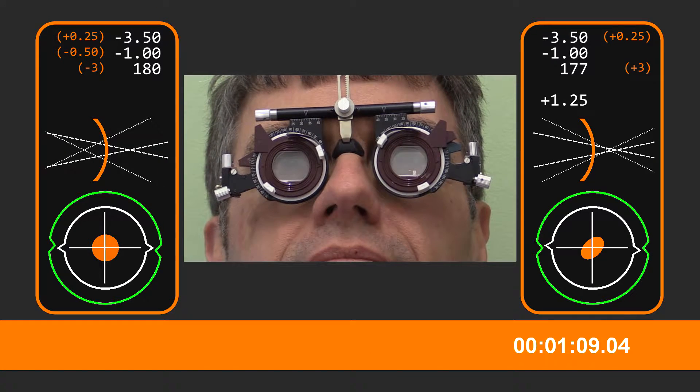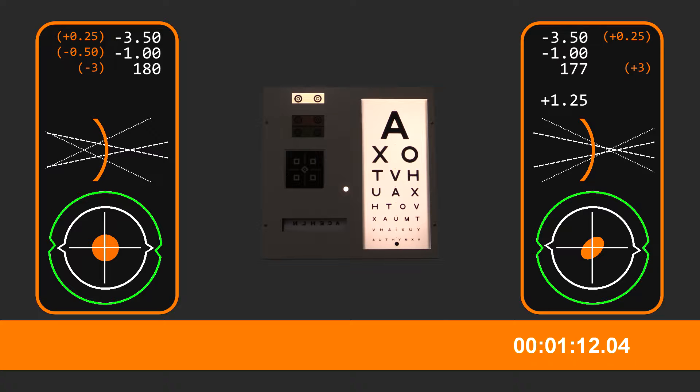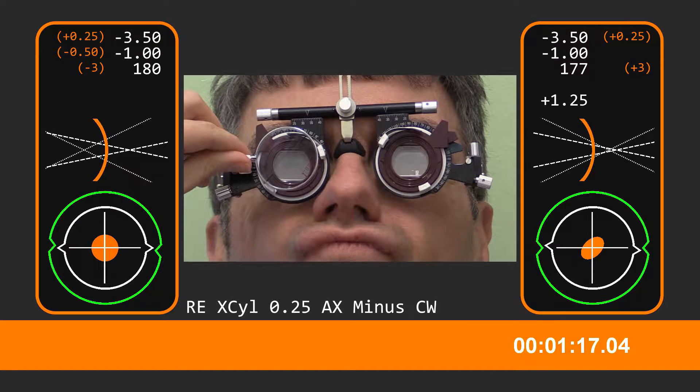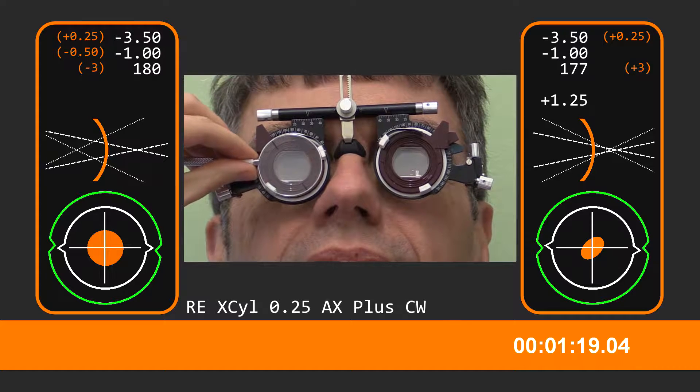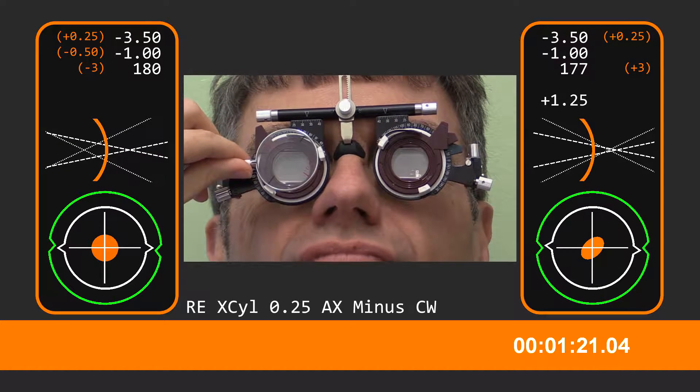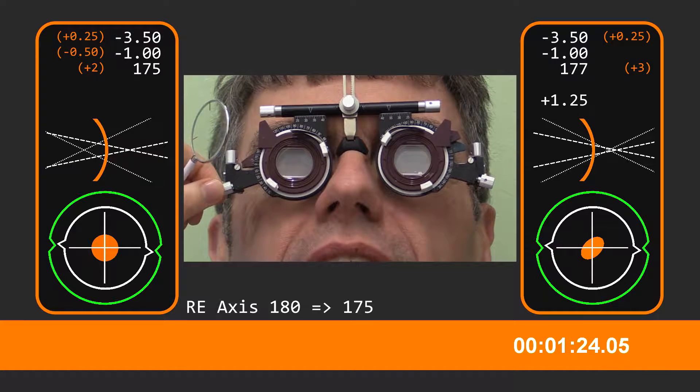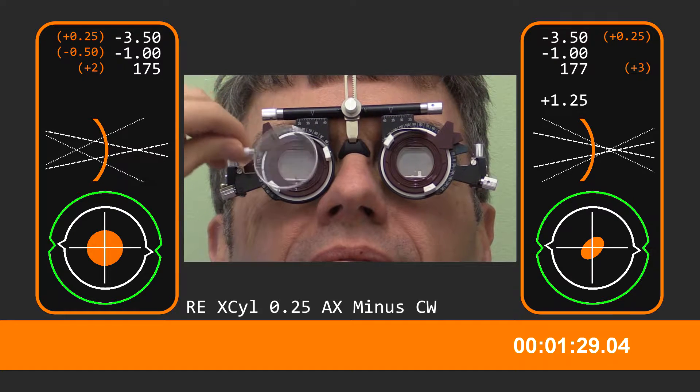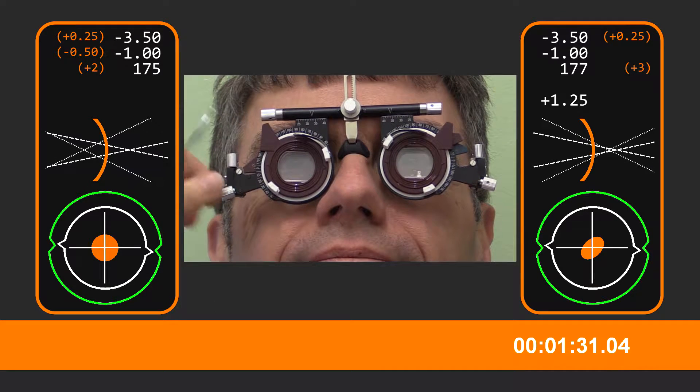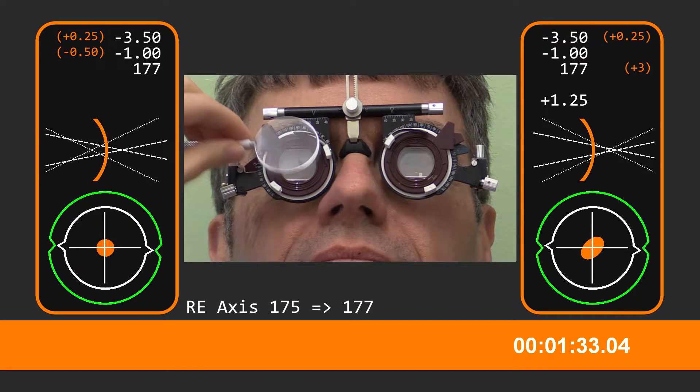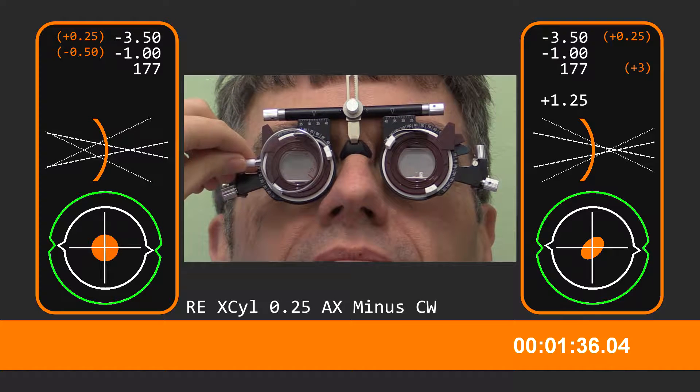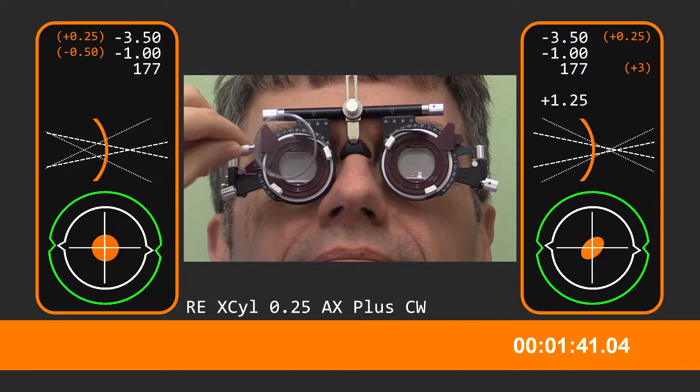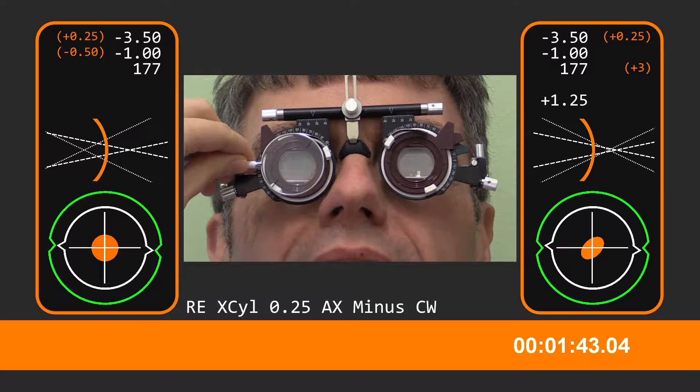Looking at the white background and the circles on it, are the circles rounder and clearer with one or two? We're about the same. So that's one and that's two. Possibly two, but really not very much. Not much of a difference. Okay, let's fold it a little bit there. One or two? Two. Okay, and one or two or about the same? One percent. That's one and that's two. Probably about the same, I reckon.